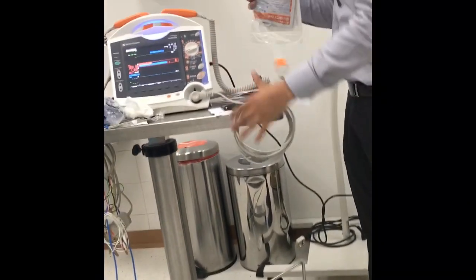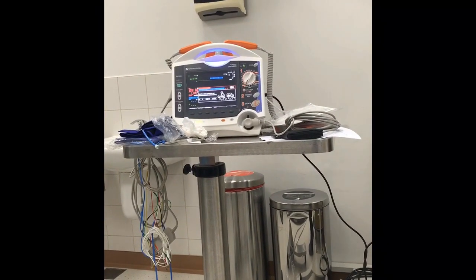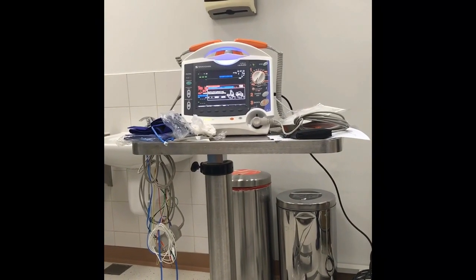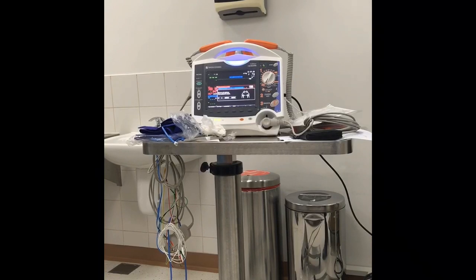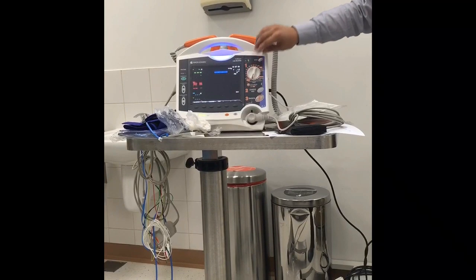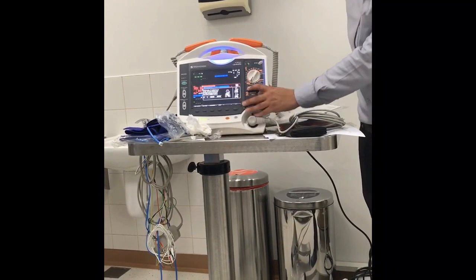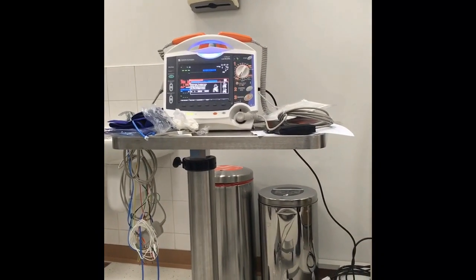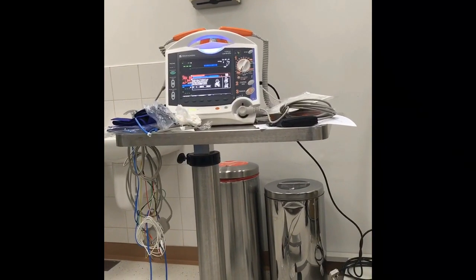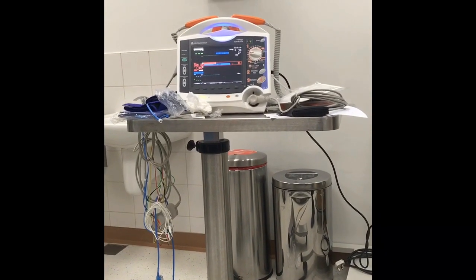Now this is for adult. Open the package and remove the pads. I need child, so press here and keep pressing. Child mode. If the patient is an adult, set the control dial to AED without pressing the child mode button. Confirm that the patient is not responding. You are in the medical field, so no need to listen to this message. This AED scenario is even for the public. Attach the pads and the machine will go directly to analysis. But because of the AED protocol, you have to do this introduction.